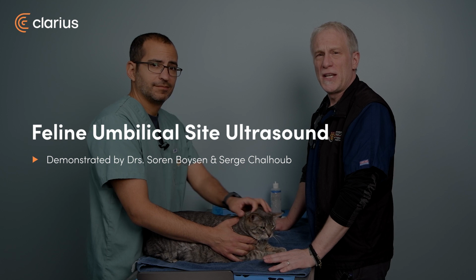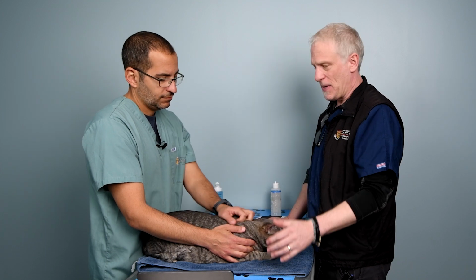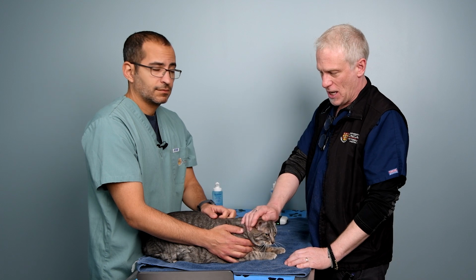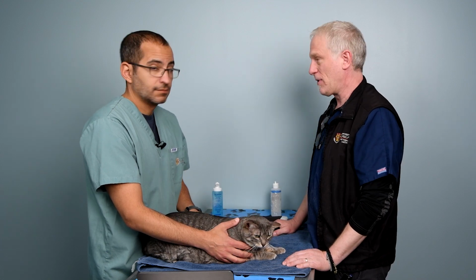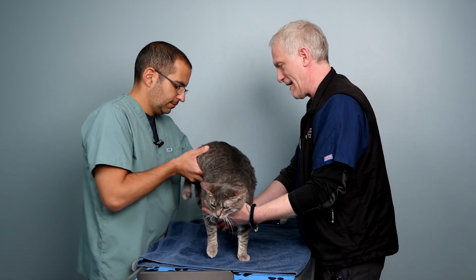So now we're going to move our attention to the umbilical site. This is probably one of the easier sites that we can assess. So we're going to go ahead and look at that. And again, we'll do this in the patient position that they're most comfortable. But for the sake of a demonstration, we are going to place Daisy here in right lateral recumbency so we can look for and answer the questions we will find at that umbilical site.